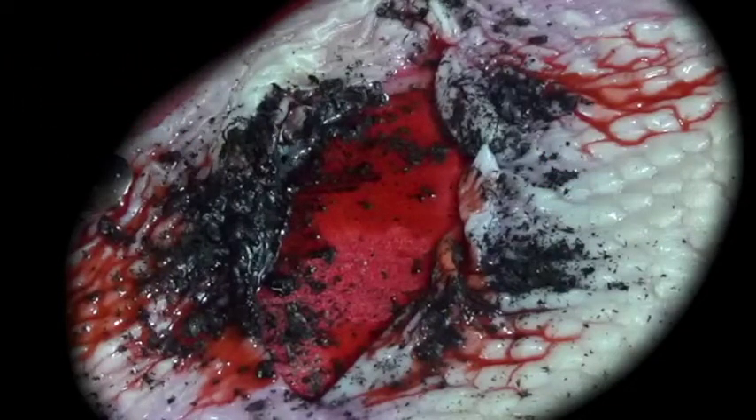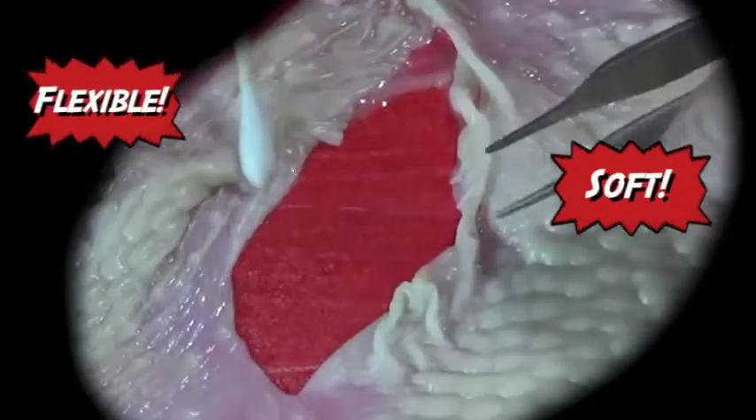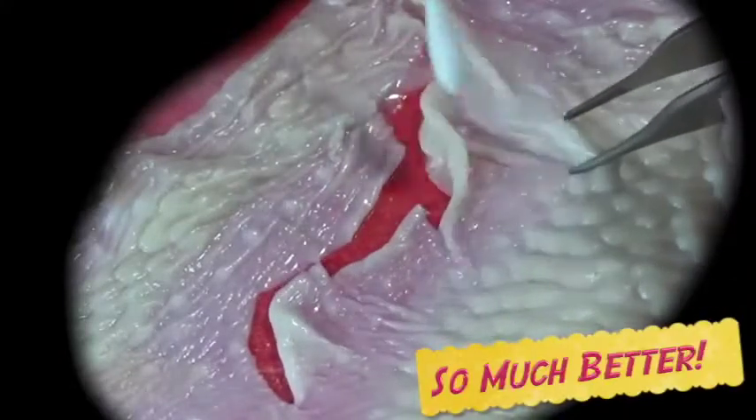In many cases, topical anesthetic alone is enough. Soaking the entire wound both cleans it and makes the skin flexible again, and once you've done that, if you gently stroke the wound margins with a moistened swab, you'll often find large amounts of viable skin that were hidden before.